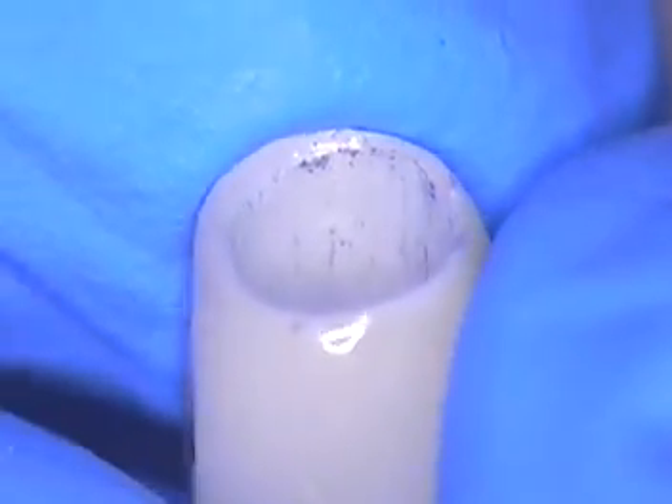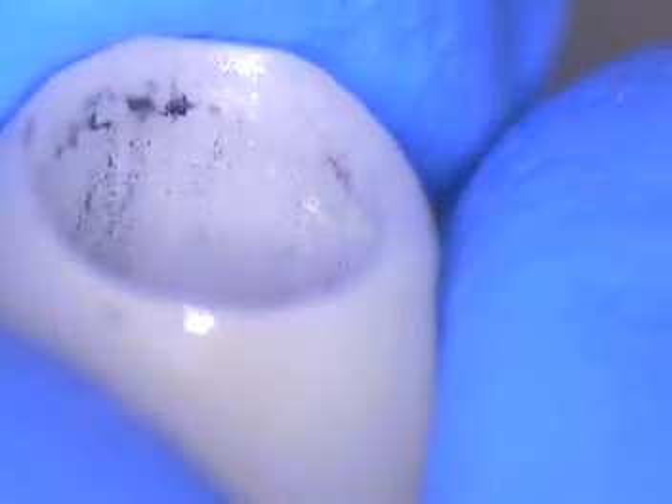It looks like we've got a little bit of something on the lingual, so I'm going to have to polish that off. I just got this back from the lab — it could be water, moisture, or something. We'll polish that. Crown work: I always double, triple check internally. You can see some of the metal actually rubs off on the zirconia. The main thing I look for is right at the lip of the margin — I always look for any type of glaze. If you see a clump, polish that off and then recheck your crown. I found a few with this case and was able to correct it and adjust the contacts. You can see the red marks where I've been checking the contacts.